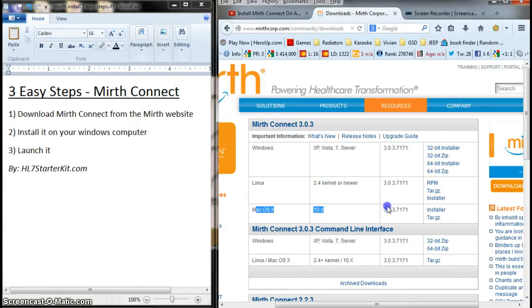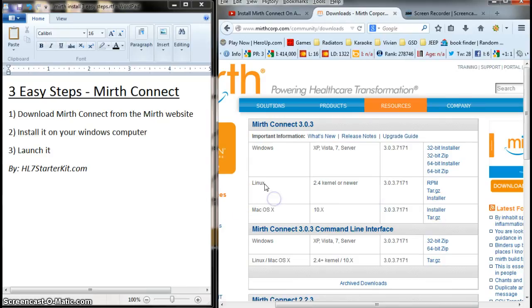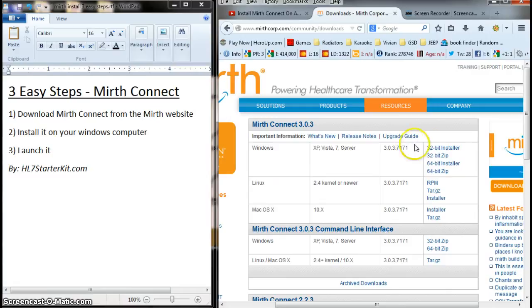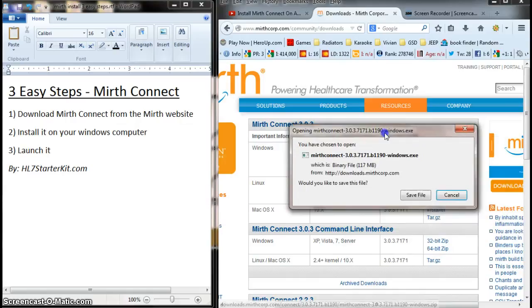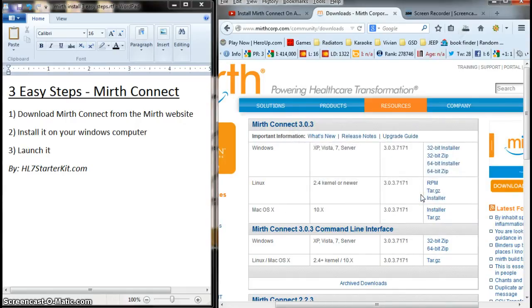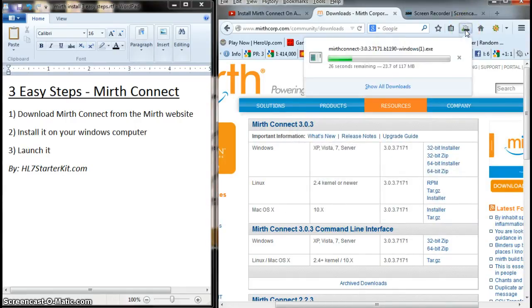Here's the Mac version if you need the Mac. Again, I did a video for that. If you have Linux, but we have Windows, and I have a 32-bit version, so I'm going to use the installer. I'm going to click Save File. I have Firefox, so Firefox, as you can see, starts to download it.